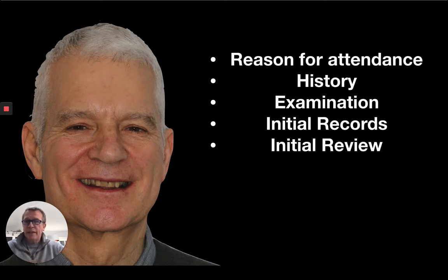And thirdly, I tell them that we're going to use those pictures to help us plan the treatment if we get to that stage. So we've got those, we've got the x-rays, and we can really sit and start to point out what the problems are and how those problems that we see relate back to what it is that the patient is looking to achieve with this treatment.